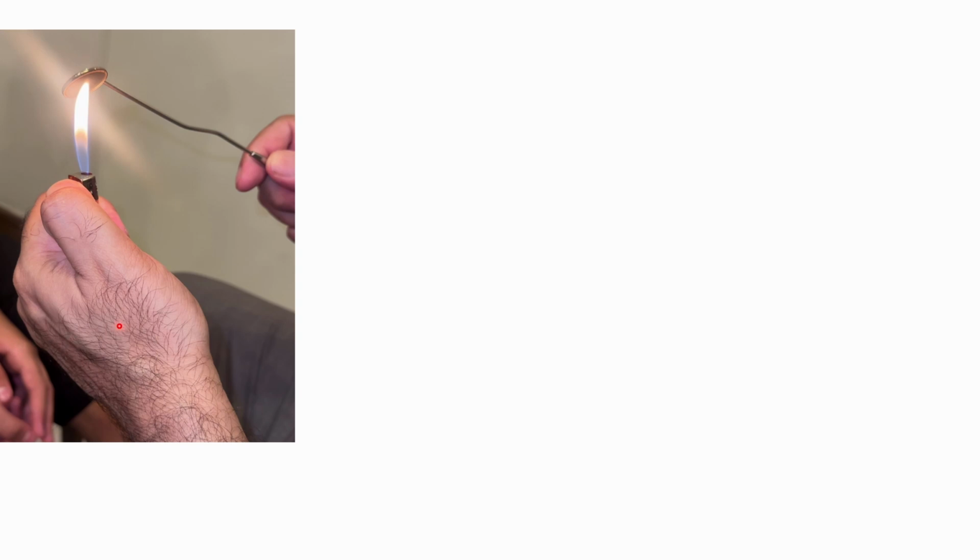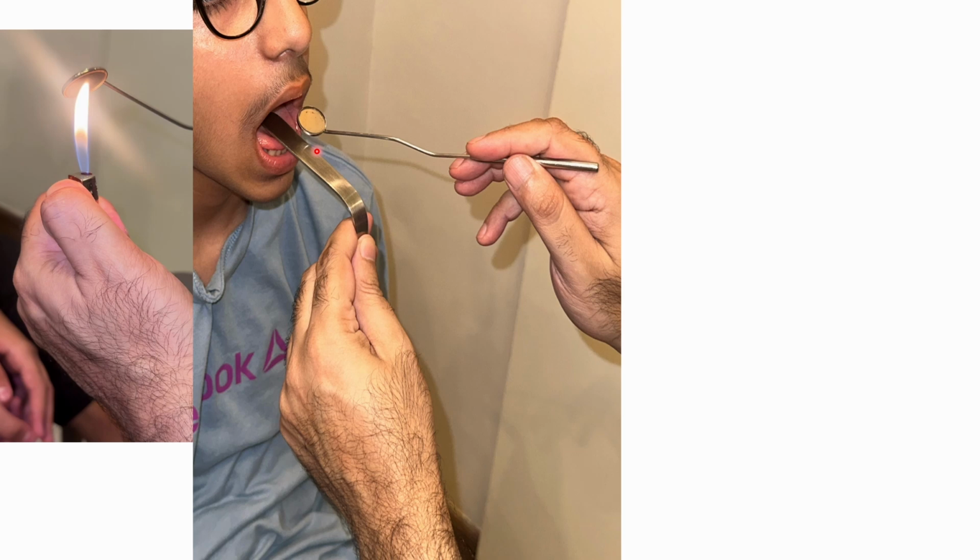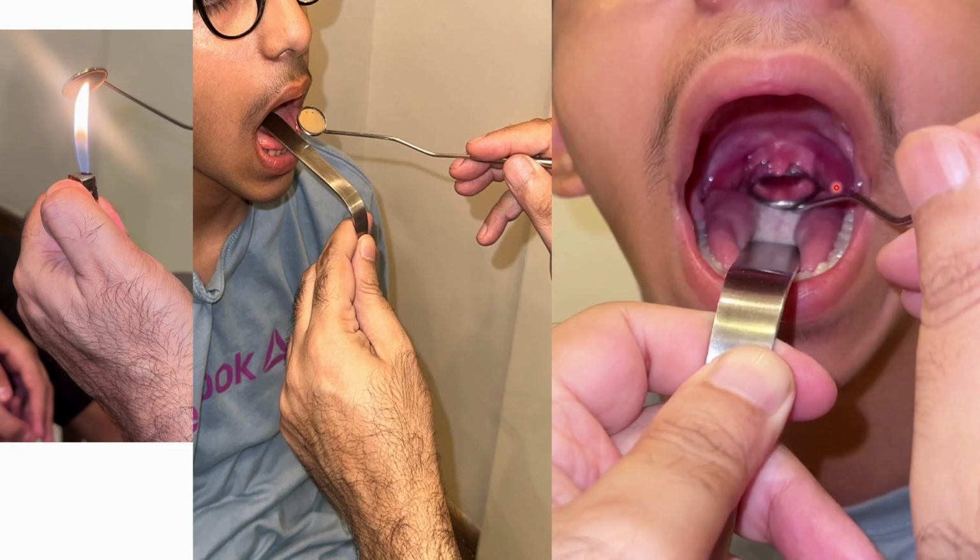And if it is not too hot and is an acceptable temperature, then depress the tongue and introduce the mirror facing upward. The mirror will be in the right hand and it should be held like a pen. You should hold it like a pen and introduce it inside, and then we have gone behind the uvula and we are able to visualize the structures.